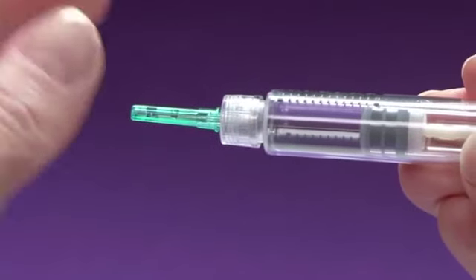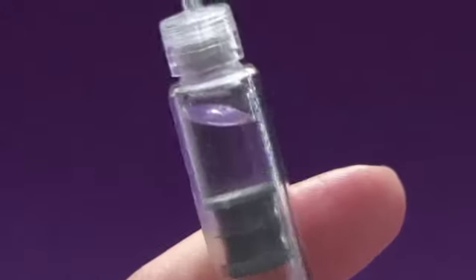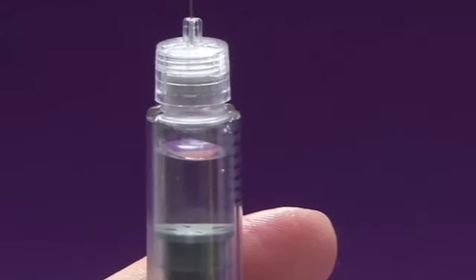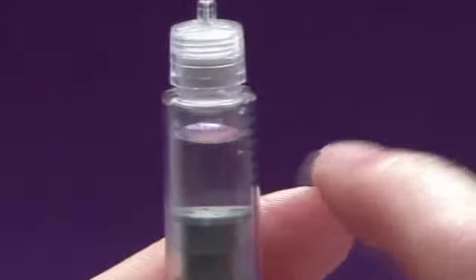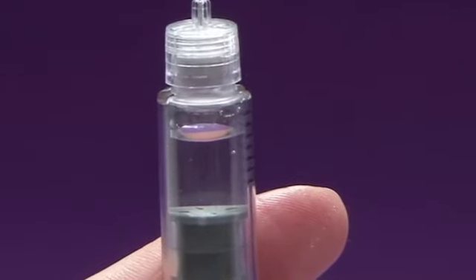Remove the inner needle cap. Hold the pen with the needle pointing upwards. Gently tap on the drug reservoir to allow the large air bubble to rise to the top. It is normal for a few small air bubbles to remain.